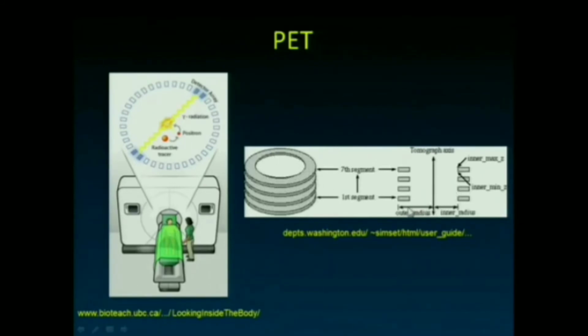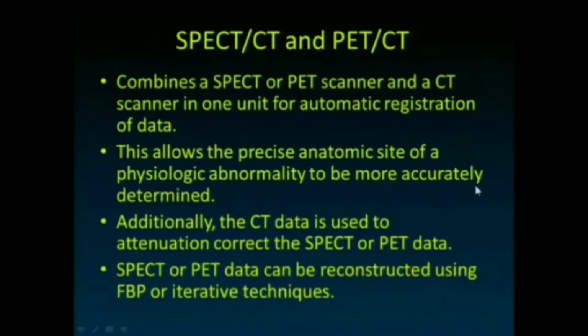Remember I mentioned that in the old PET scanners you would see collimators in there, and they were really in place so that you restricted to only detecting events that were traveling in this direction and not so much detecting events in this direction. In other words, we operated the old PET scanners in 2D mode, where they were detecting, if you will, events occurring in a single slice and not allowing 3D detection of events. That has really changed.